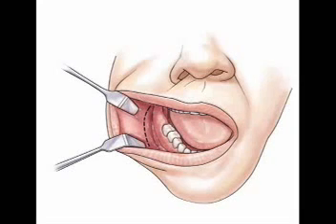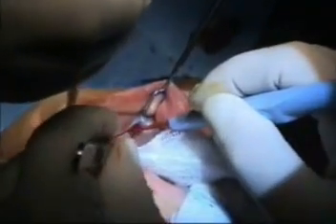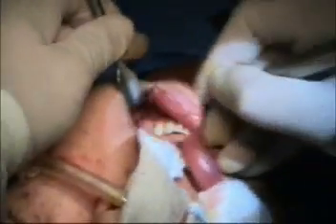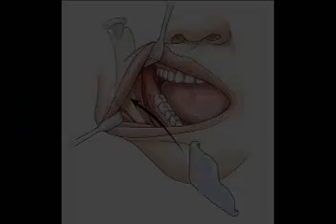The surgery is performed through an intraoral incision high on the labial side of the sulcus. This placement allows a watertight closure and prevents pooling of saliva in the postoperative period and subsequent contamination of the implant.